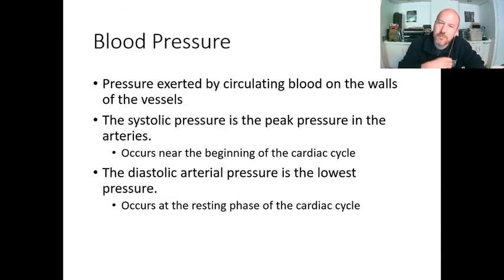Finally, blood pressure. I routinely check blood pressure before I do any CT scans. I think people are crazy not to, and I know that people commonly don't. I worked at a lot of facilities where they thought I was crazy for doing a blood pressure until I started noticing that a lot of patients had really high blood pressures, and then they questioned, why are we doing a CT scan? We need to do something else.